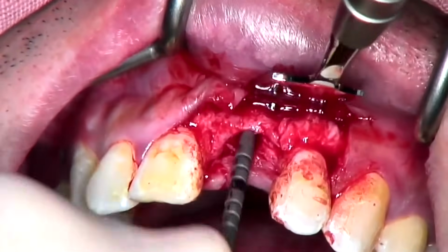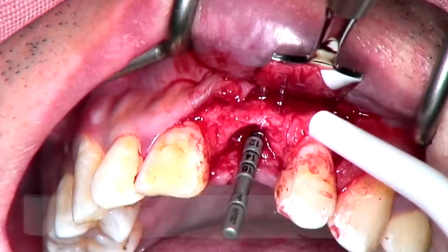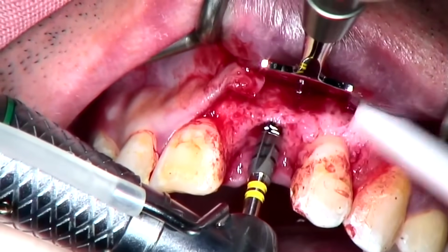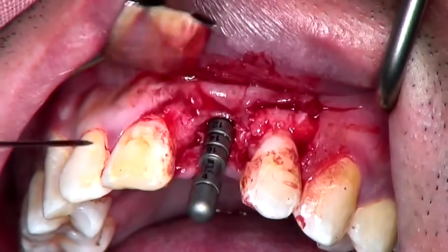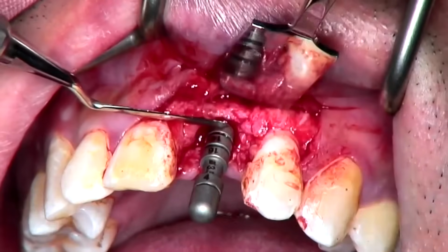After the first drill, we can control the depth and angle of our osteotomy with the respective 2.2 millimeter gauges. The drilling sequence continues with a 2.8. After each drill, the gauge will help us control the depth and angle of our osteotomy and match it to the planned prosthetic position.